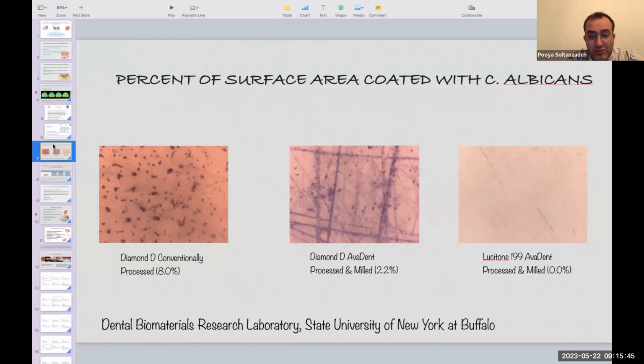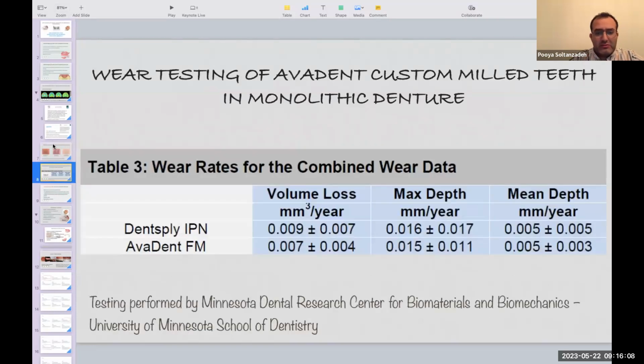So this is really important because a lot of people, if you see that they're wearing dentures for a long time, the dentures smell, especially if the oral hygiene is not the best. So you can appreciate the smell and the odor coming from the dentures. And in many cases, we recommend to replace them or soak them every night into solutions, all those things. And this is a very good and great advantage and improvement.